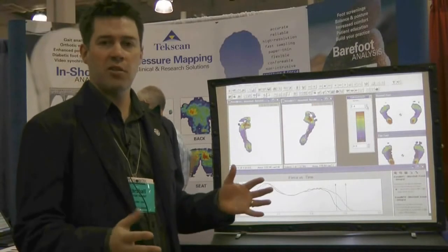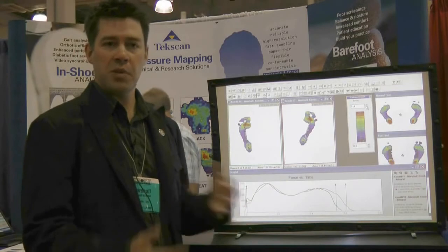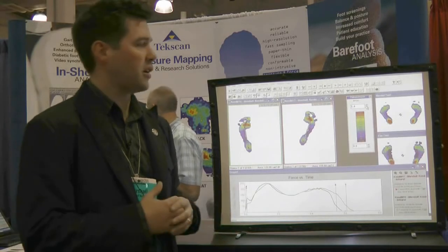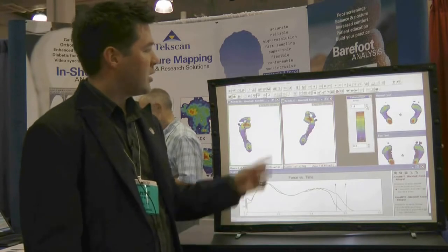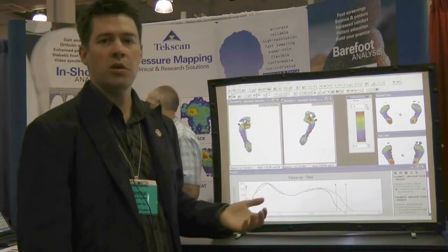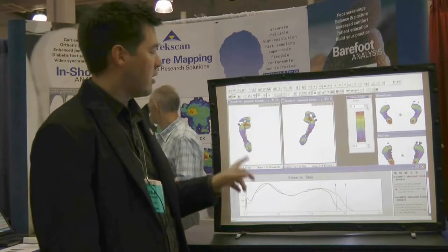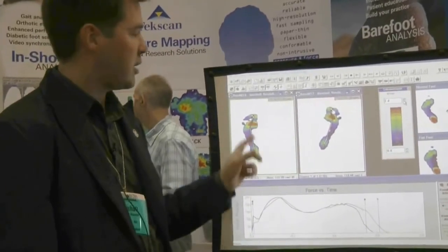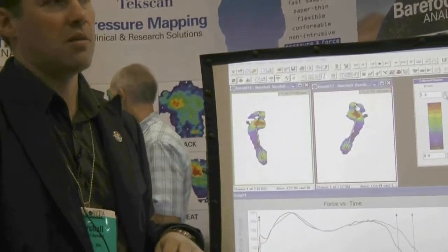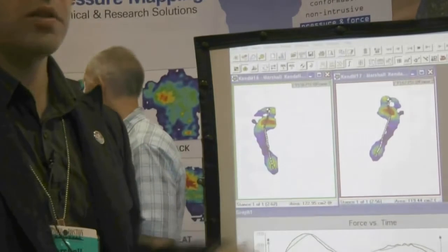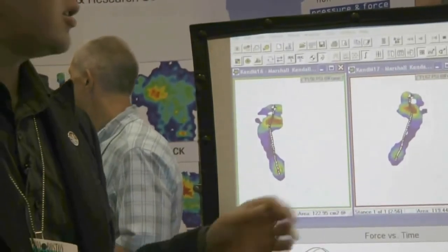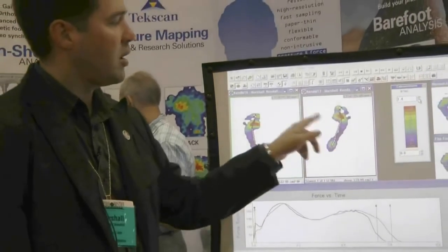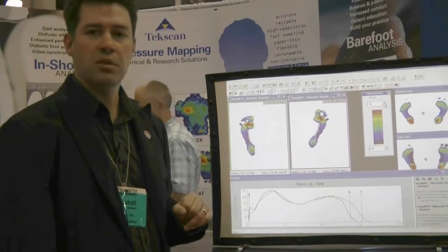The MatScan can be used for barefoot analysis with diabetic patients. A lot of the problems with diabetic patients is they can't feel well — not everyone, but there are a lot that have problems with sensation at the feet and therefore can't tell if they are putting a lot of force or having a lot of pressure under the foot. We have a function with the MatScan that allows us to look at the actual loading rate while someone is walking dynamically — it's our integral impulse under the foot — and it will show red for high loading rate values. In the diabetic literature they're starting to look more at the impulse and the amount of loading rate during gait to determine if there's any potential ulceration problems further down the road. With a simple click of the button we can do that calculation with our system and locate those potential problem areas for treatment of diabetic patients.